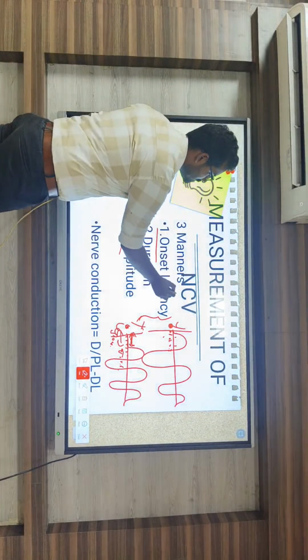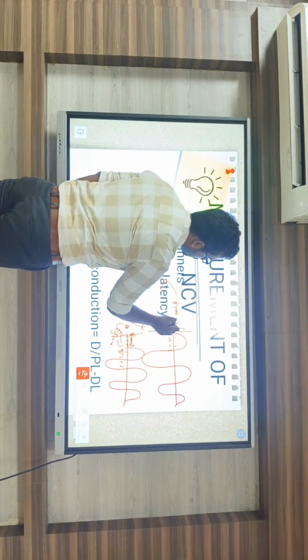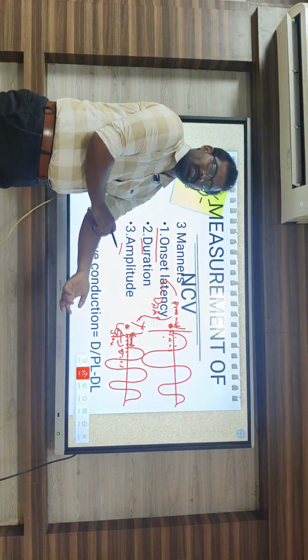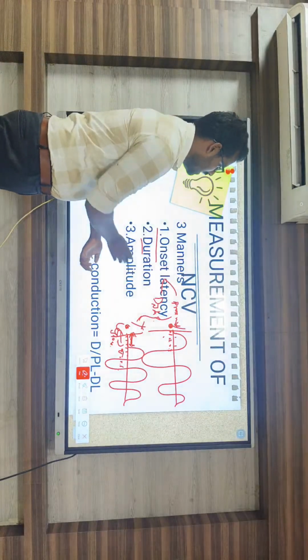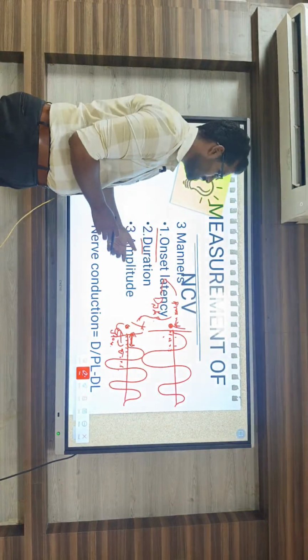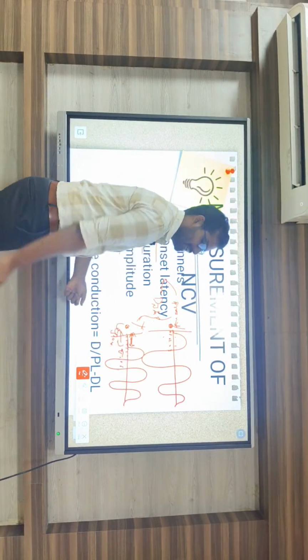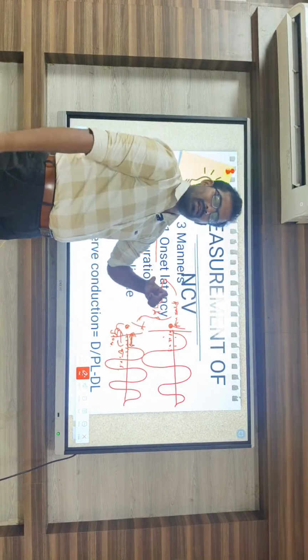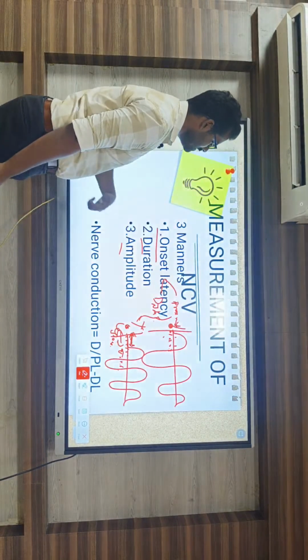In this latency we have two types, that is the proximal latency plus distal latency. These are the proximal portions of the latency period and distal portions of the latency period. Latency periods are nothing but the time in between the point of increasing the intensity knob and the muscle contractions flickering. In between is the distance, and that is based on the lesion size. Okay, that is the onset latency.